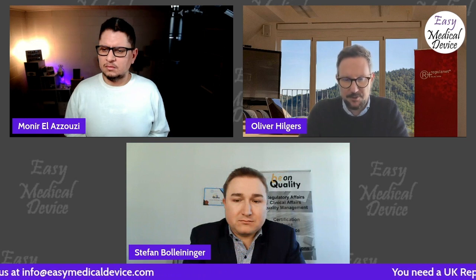But if the focus is to support the patient first, and maybe the health professional rather for, let's say, speeding up processes for admin activities, then nevertheless, if the focus is on the patient, this would not be considered a therapeutic or a diagnostic decision, because the patient will just usually follow what the software is providing. And that brings us to the next topic, where maybe the software can provide kind of a therapy.